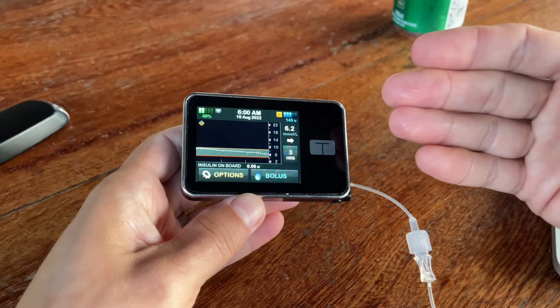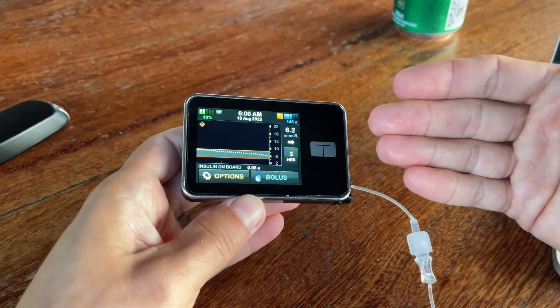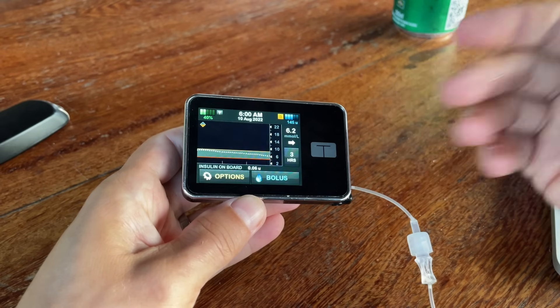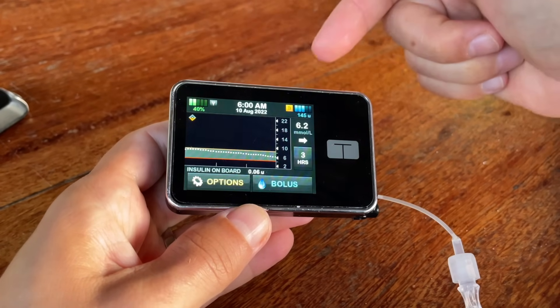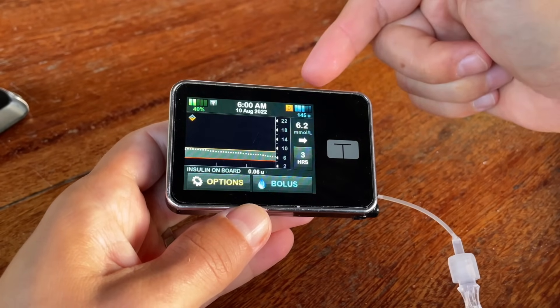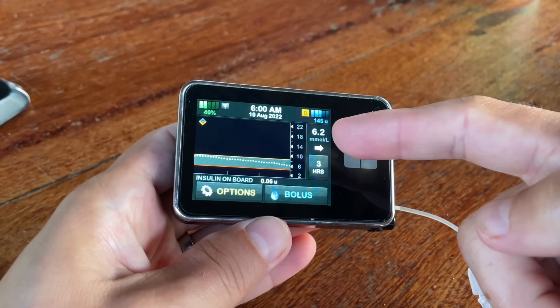Now I'll stop complaining and talk about all the things you can do with the Tandem T-Slim X2 and why I find it so amazing and smart. The way Tandem presents all the data on the home screen is excellent — you have everything you need right in front of you: time, how much battery capacity is left, and how many units of insulin remain in the pump.